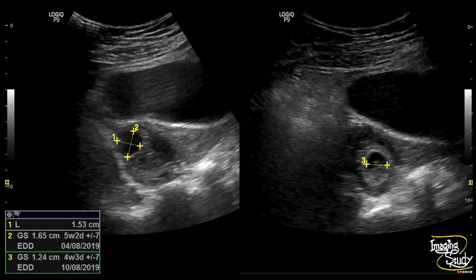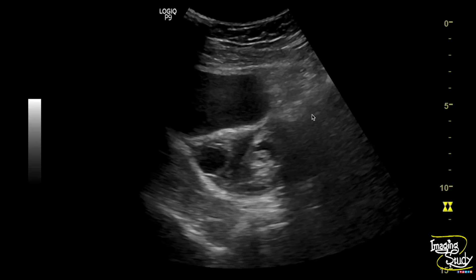Here you can see the right adnexal region of the patient. The uterus was normal. When evaluating the right adnexa, we found a complex area which might be an enlarged ovary, as the right ovary was not separately visualized. We found an anechoic cystic area and thought this might be the ectopic pregnancy, but we also found another cystic area with a hyperechoic margin within this lesion.